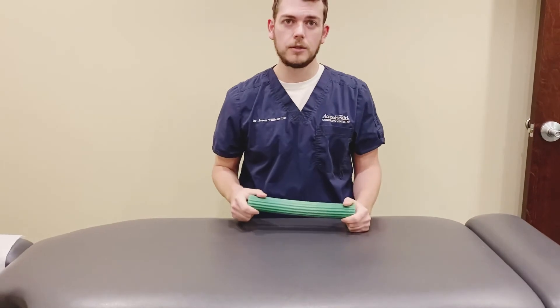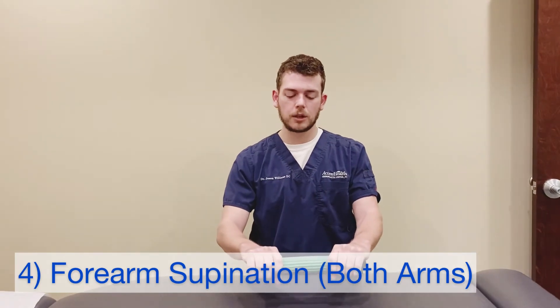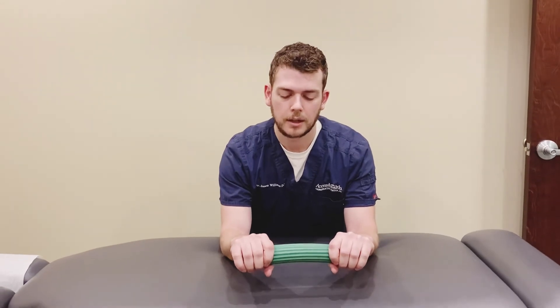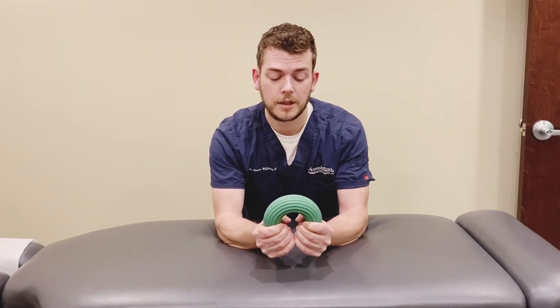To work on the bilateral supination, we're going to grab both ends with our palms facing down, anchor our elbows against the table, and then bring the ends together — but they're down instead of up.